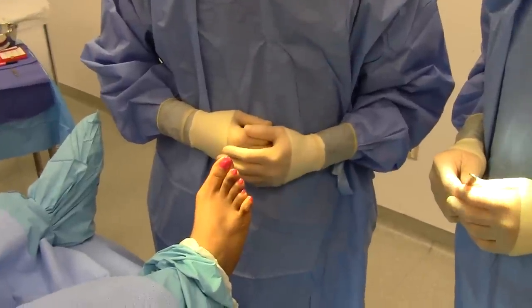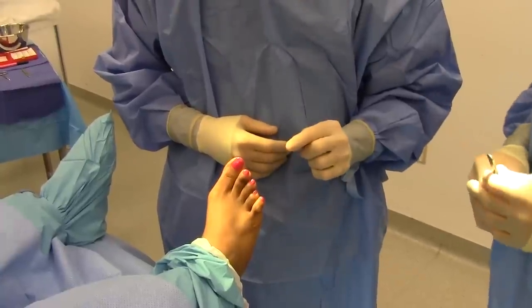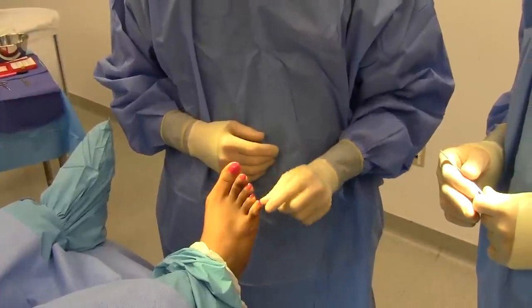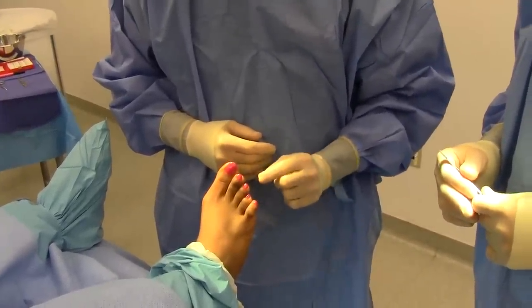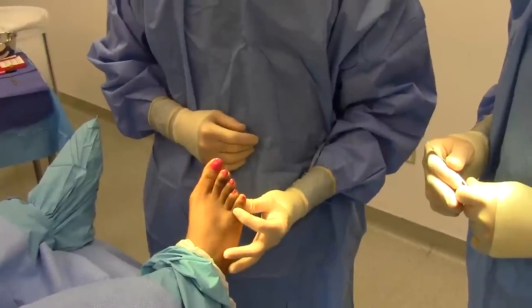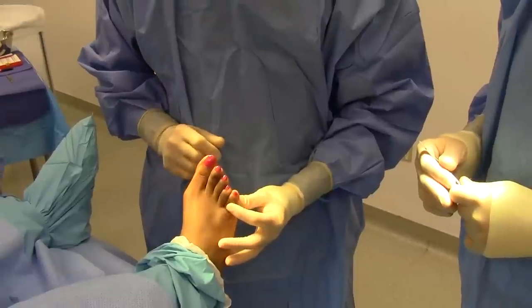This patient has a hammer toe deformity of the fifth digit, so today we're going to straighten the hammer toe with a cannulated digital implant that sits right in the middle of the bone. There will be no K-wires exposed — the complete reconstruction will be all internal. The patient will have a nice straight toe at the end of the procedure.